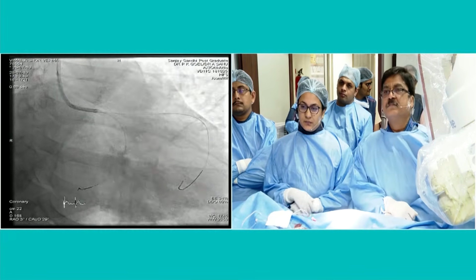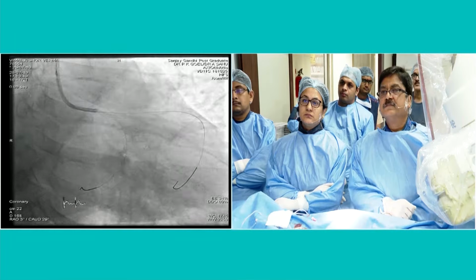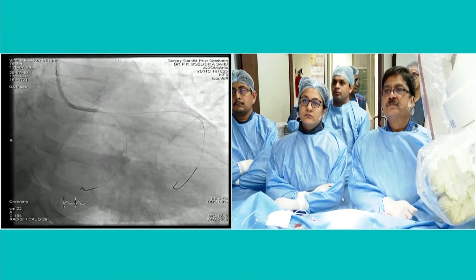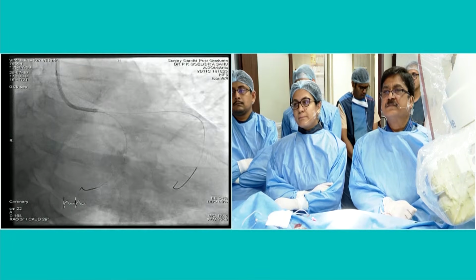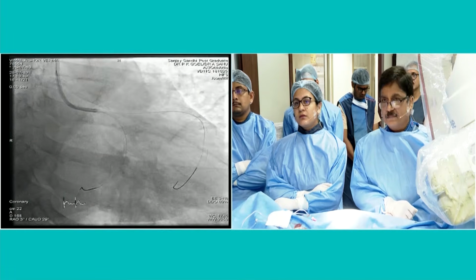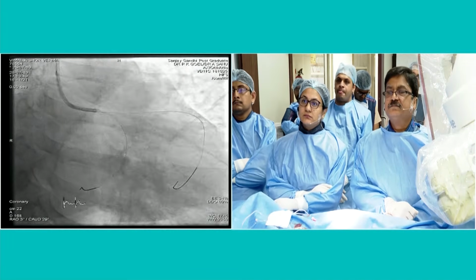So so far, this is exactly what I will do. We need to clearly assess the size of the left main, considering, as you said before nicely, that if you look at the circumflex, the left main must be even bigger than that circumflex. Yes. And in order to understand the real size, if you don't do IVUS, you're just eyeballing. And that's absolutely wrong.